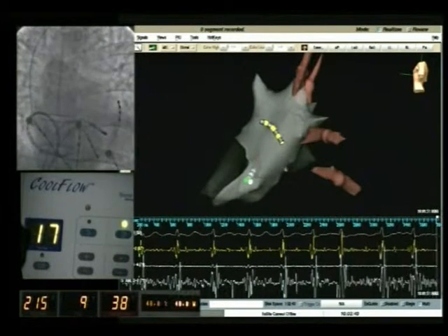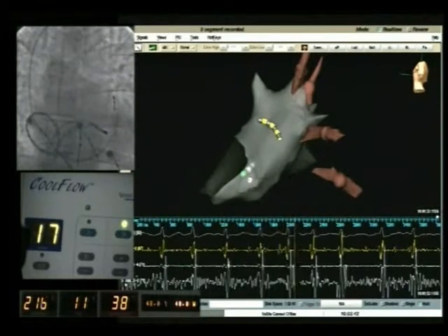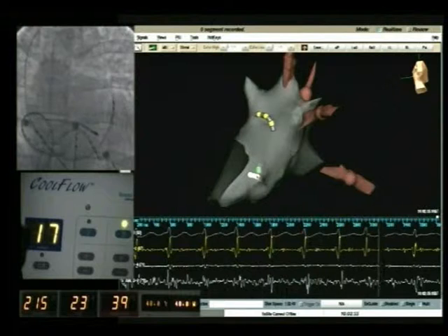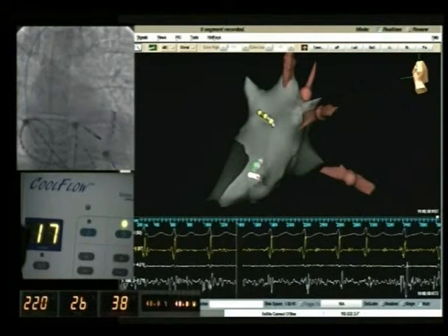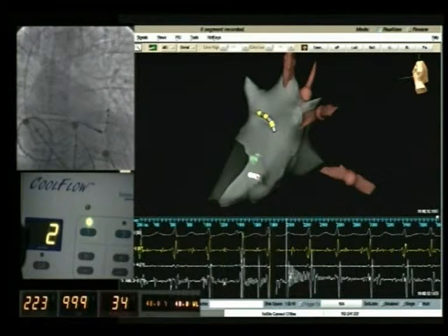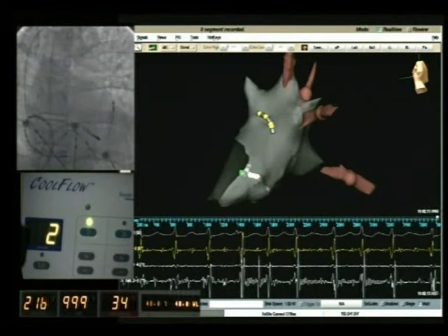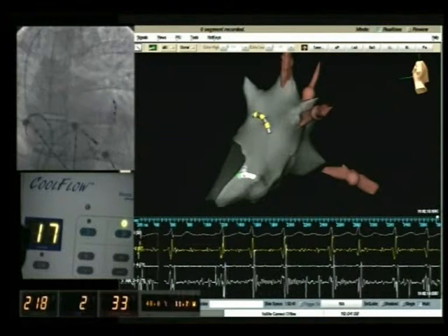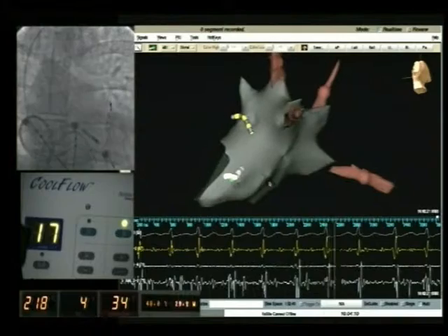On the bottom left panel, from left to right, impedance, ablation time and tip temperature are shown. These values are constantly monitored. Irrigation rate is titrated to achieve the desired power. Energy output is limited to 40 watts and 48 degrees Celsius throughout the entire ablation procedure.